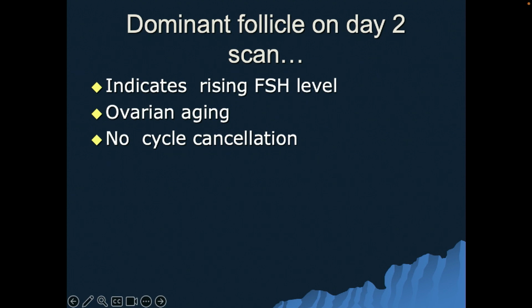Now if I say hemorrhagic cyst, remember hemorrhagic cyst is a term only used for those lesions where the corpus luteum has stopped functioning, so has no flow, but still anatomically has not regressed. That means it's hormonally not active, it's not going to come in your stimulation, don't bother about it, go ahead with your stimulation. That means there is only one lesion which you have to remember, the residual active corpus luteum, and it's only in this lesion that you cancel the cycle. For all the rest you can go ahead.